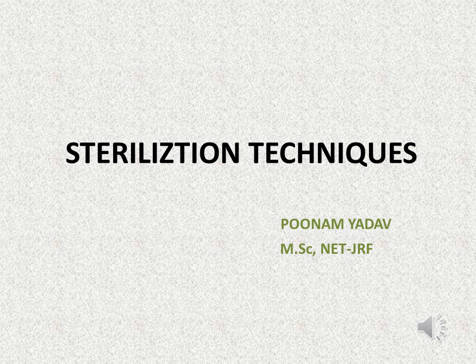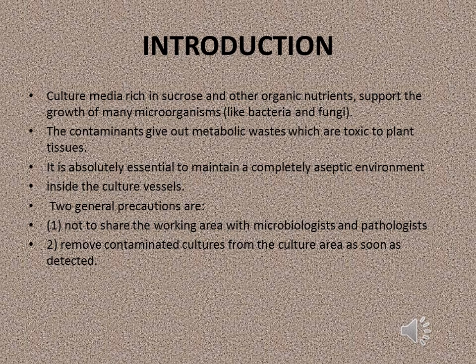Hello everyone. Today our topic of discussion is sterilization technique. Plant tissue culture media rich in sucrose and other organic nutrients support the growth of many microorganisms like bacteria and fungi.